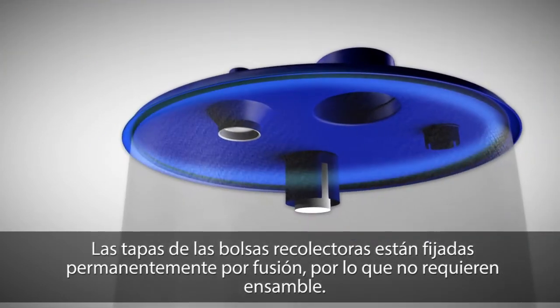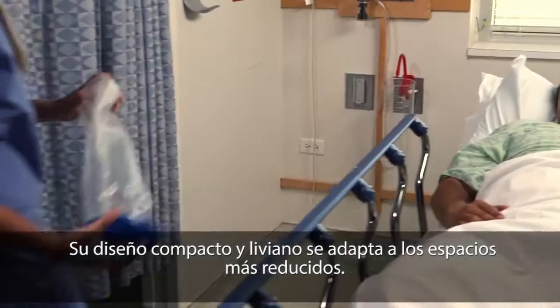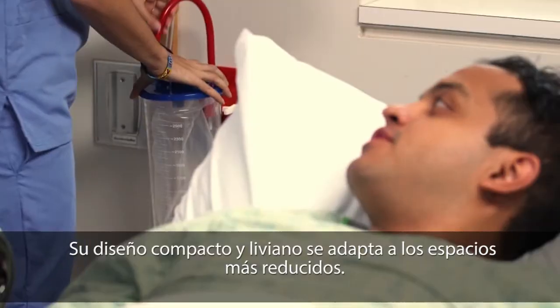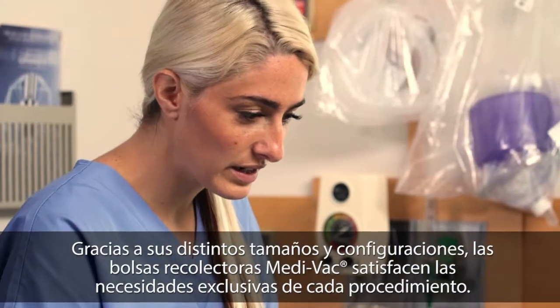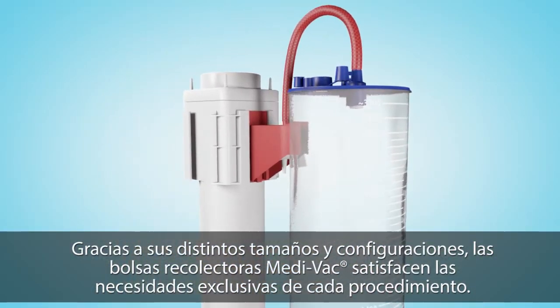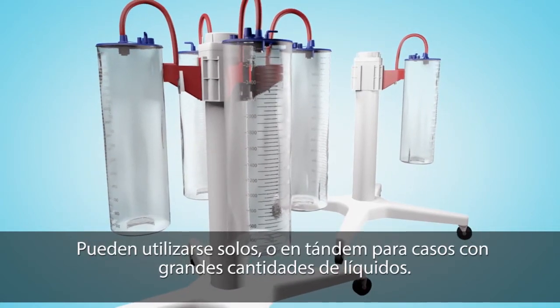Liners are permanently attached to the lids, so no assembly is required. Their compact and lightweight design helps to minimize storage space requirements. With a variety of sizes and configurations, Medivac flexible liners meet the unique needs of various procedures. They can be used standalone or in tandem for large volume cases.